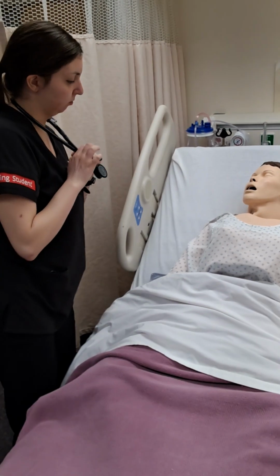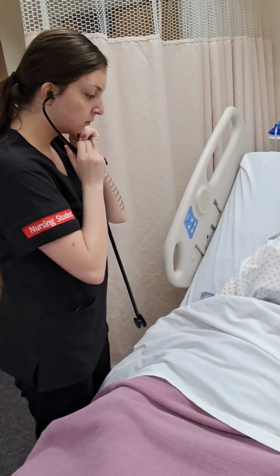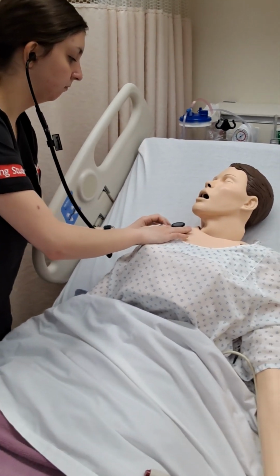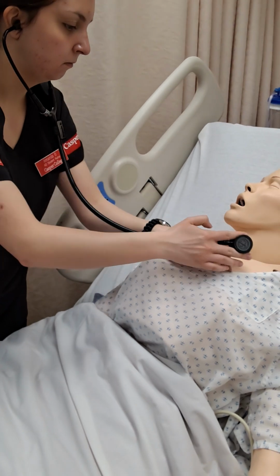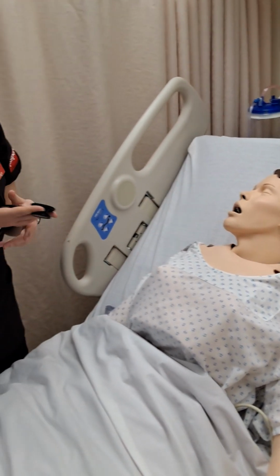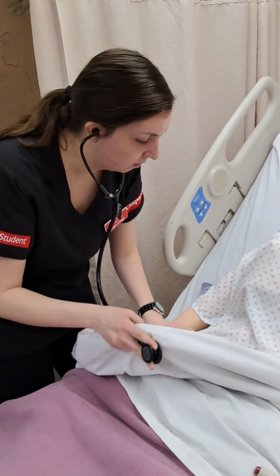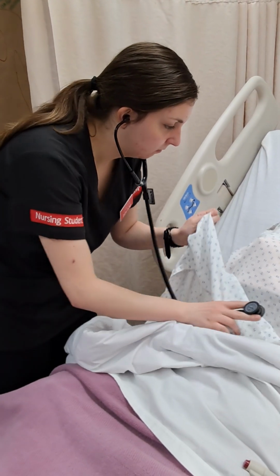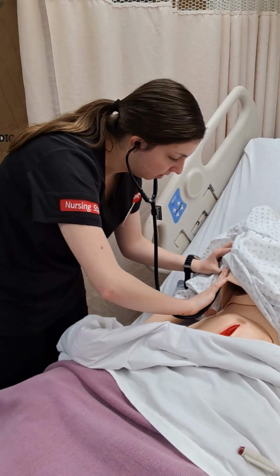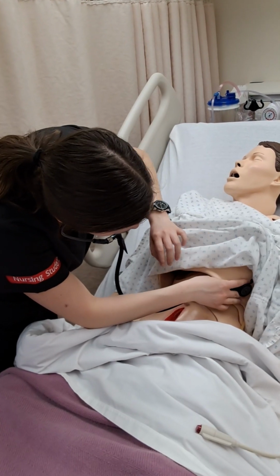Okay. When I tell you to breathe in, just breathe in normally. Breathe in. Breathe in. Is it okay if my stethoscope touches your skin? Yeah, okay. Breathe in. Breathe in.